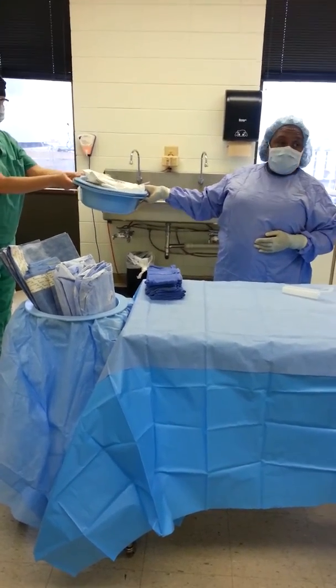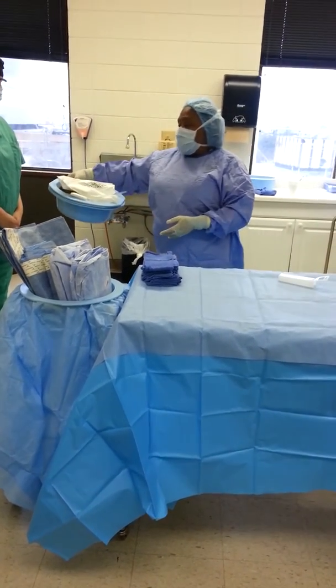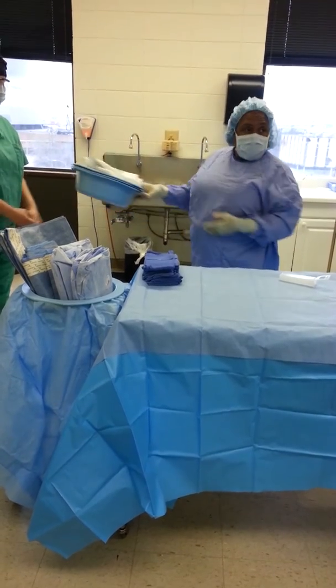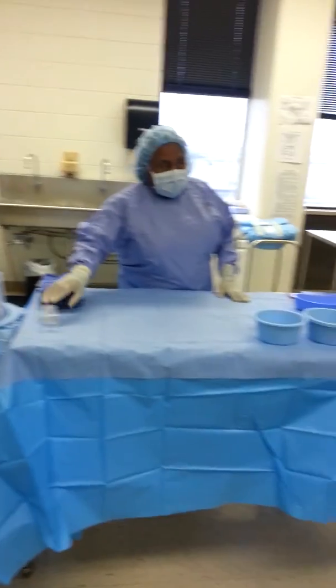So you see, there's no way we can get contaminated. Oh, here, take this. Hand it off like that. All right, so that's your basic setup on your table.